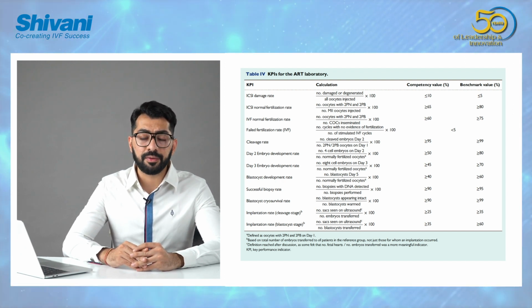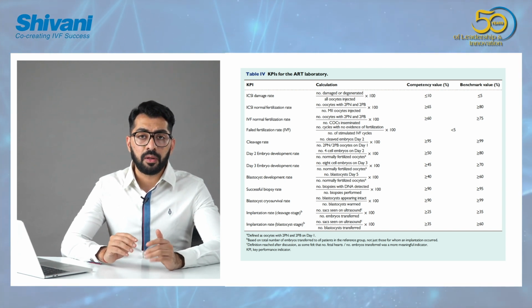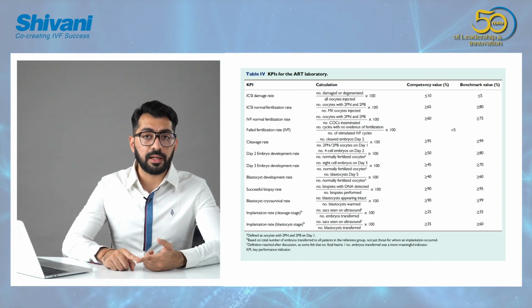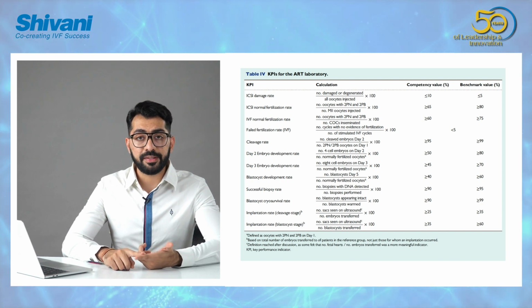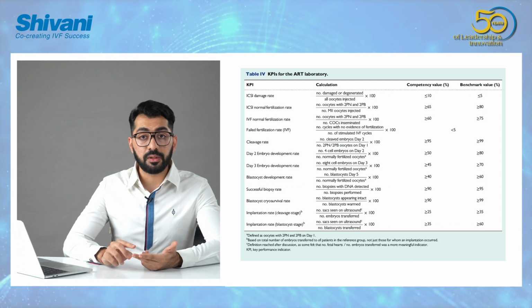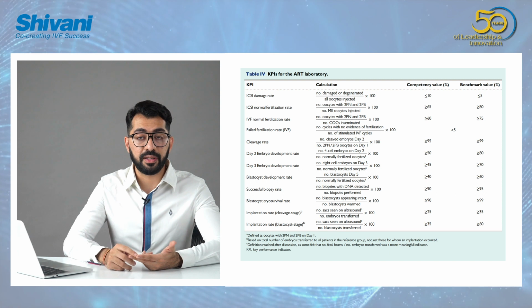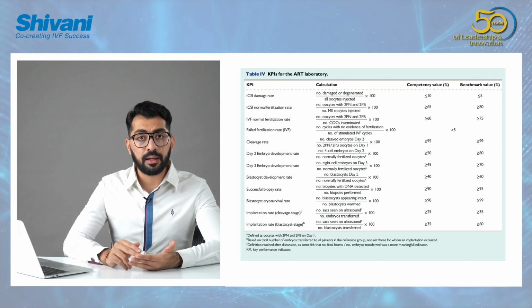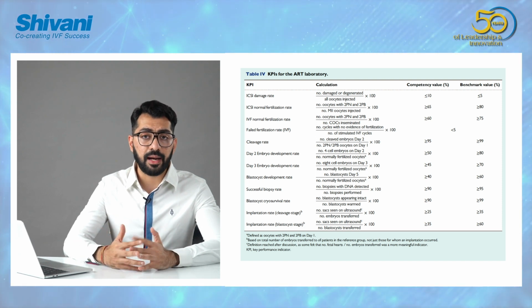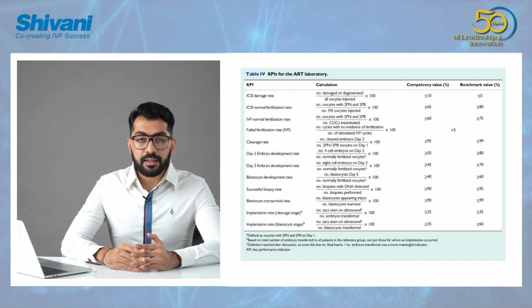for IVF. Now when IVF fertilization rate goes down, again the things that I would want to check here would be the quality of the culture media that I'm using, the quality of the sample that I'm using, how the sample was prepared, what was the sperm motility post preparation. That was a performance indicator that we were assessing, and again, how long am I exposing the eggs within that particular sample. Okay, coming to the next indicator, and that is cleavage rate.